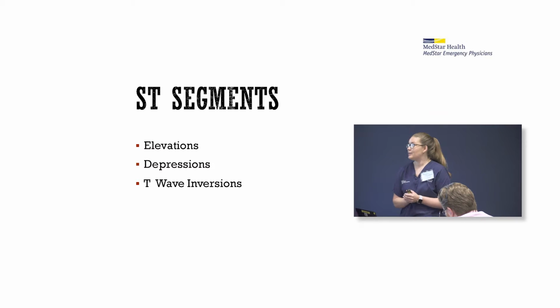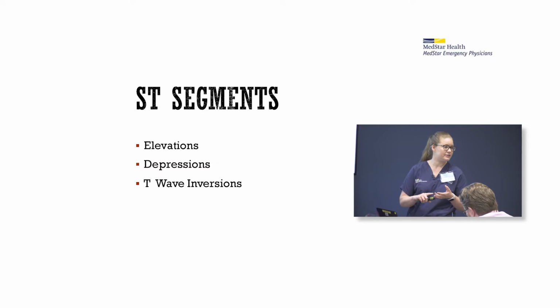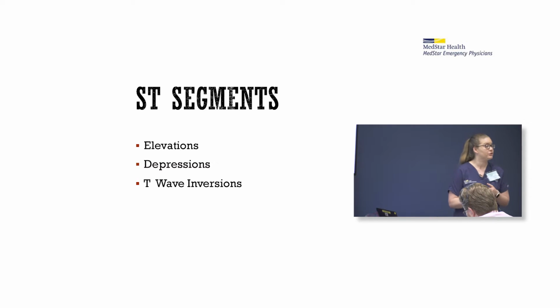And speaking of our ST segments, when you're looking at EKG, you're looking for elevations, depressions, and then I always am looking for T wave inversions too as your signs for ischemia. So I know that's a lot of information really fast. Like I said, we're going to go through this on each EKG. Everyone will have some time to practice.